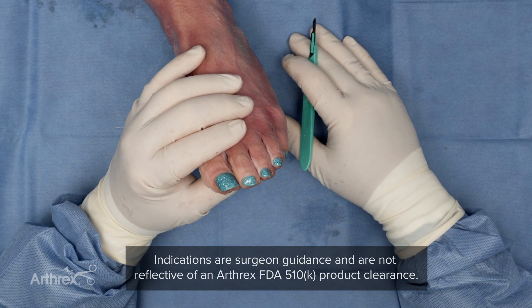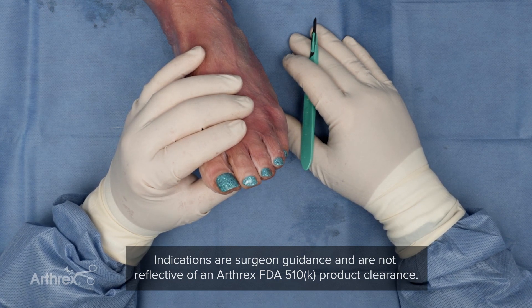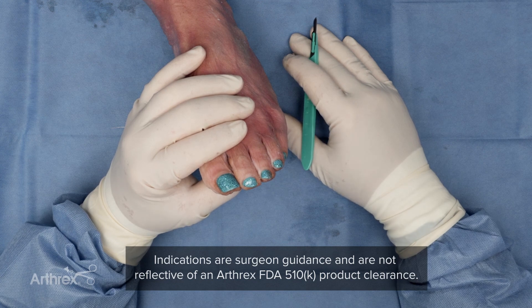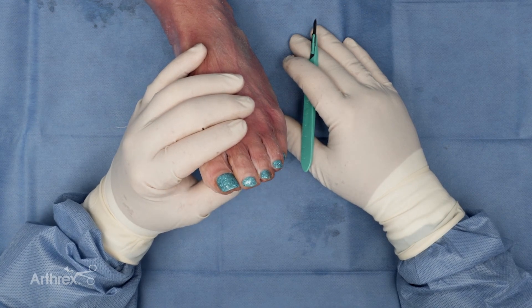This is very useful for a variety of things, not only fracture fixation, but arthrodesis type procedures. One very useful application is for hammer toes. Typically, I will do a proximal interphalangeal joint fusion, and this implant is very useful in that regard.